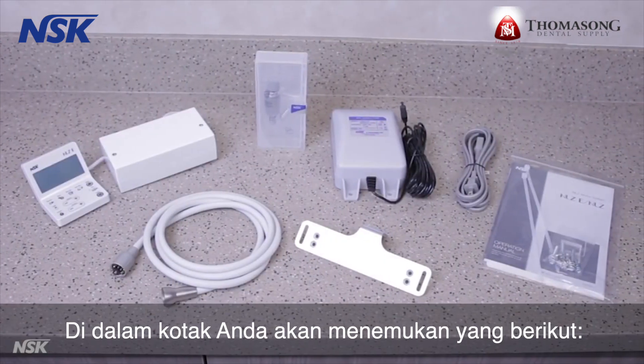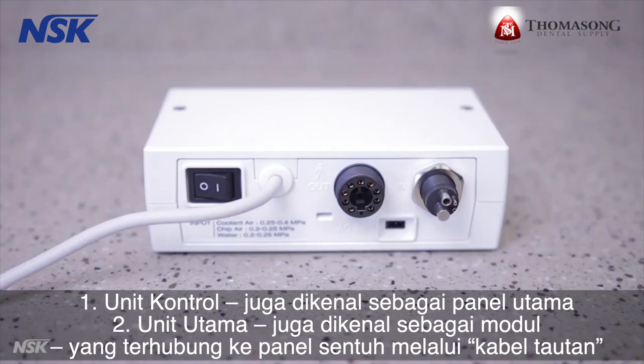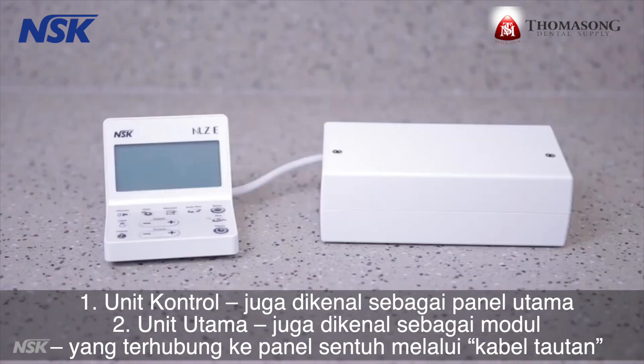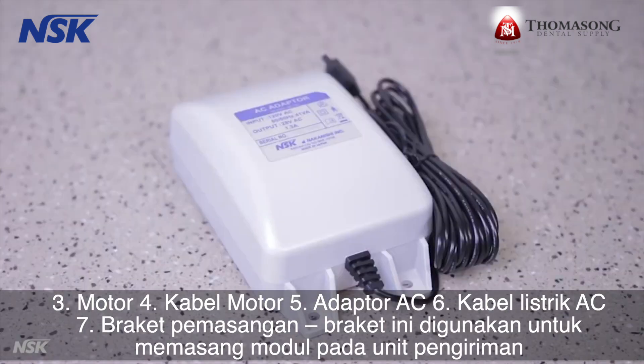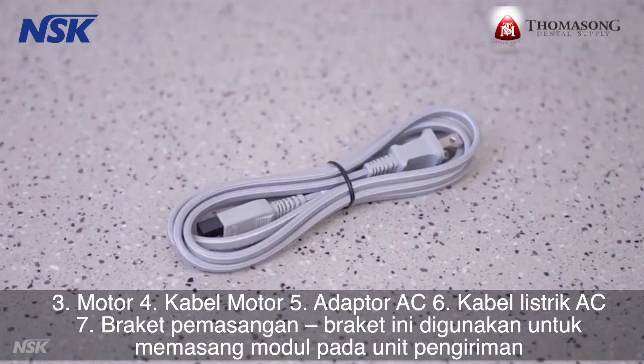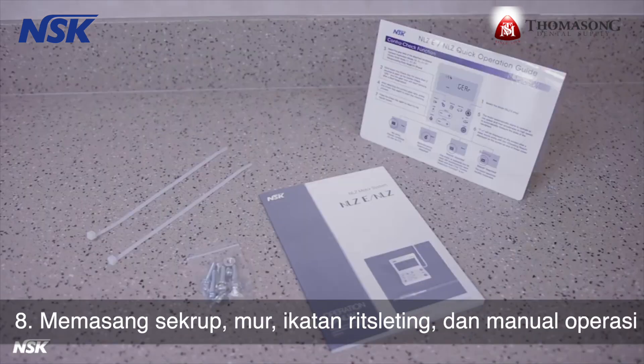Inside the box, you'll find the following: the control unit, also known as the touch panel; the main unit, also known as the module, which is connected to the touch panel via the link cable; motor, motor cord, AC adapter, AC power cord, mounting bracket — this bracket is used to mount the module on the delivery unit — mounting screws, nuts, zip ties, and the operation manual.